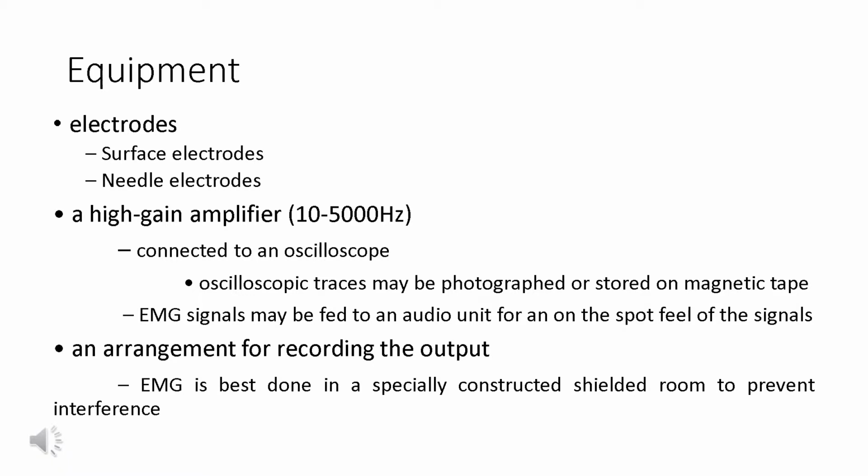Intramuscular EMG can be performed using a variety of different types of recording electrodes. The simplest approach is a monopolar needle electrode. This can be a fine wire inserted into the muscle with a surface electrode as a reference, or two fine wires inserted into a muscle with reference to each other. Most commonly, fine wire recordings are for research or kinesiology studies. Diagnostic monopolar EMG electrodes are typically insulated and stiff enough to penetrate the skin, with only the tip exposed, using a surface electrode for reference.